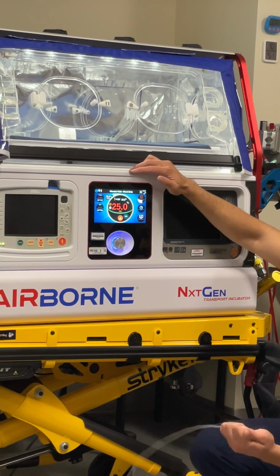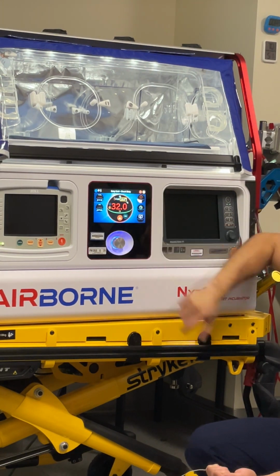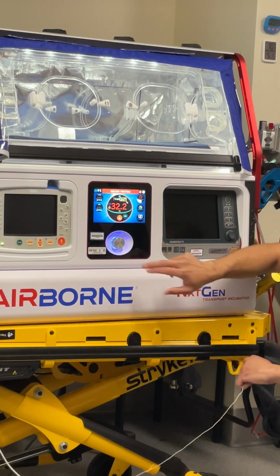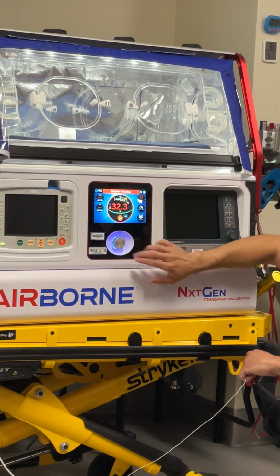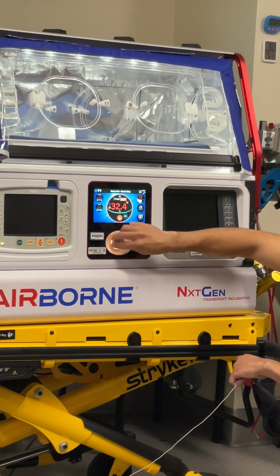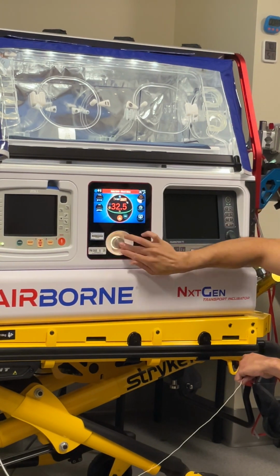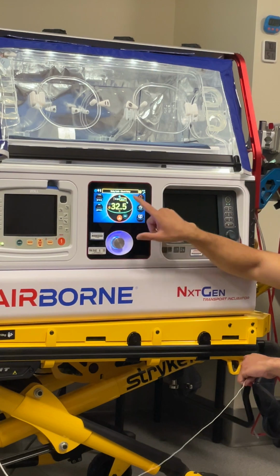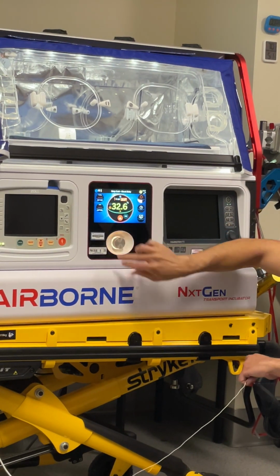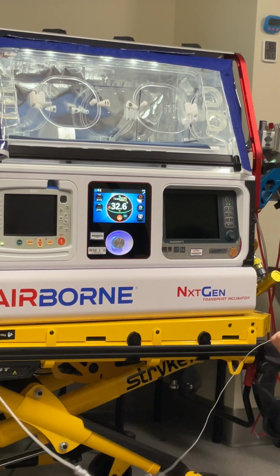Okay, so now we can switch to the servo mode. You've got to touch that little baby icon. So now there's our alarm. Baby's cold because we have it set at 37. So I'll bring it down. The first thing you notice is when I get within a degree, it goes to yellow. If I get a little closer, then it goes away. So now we're in servo.